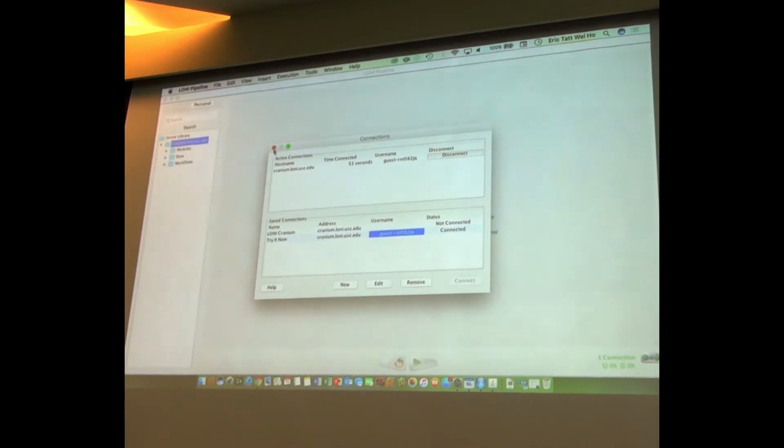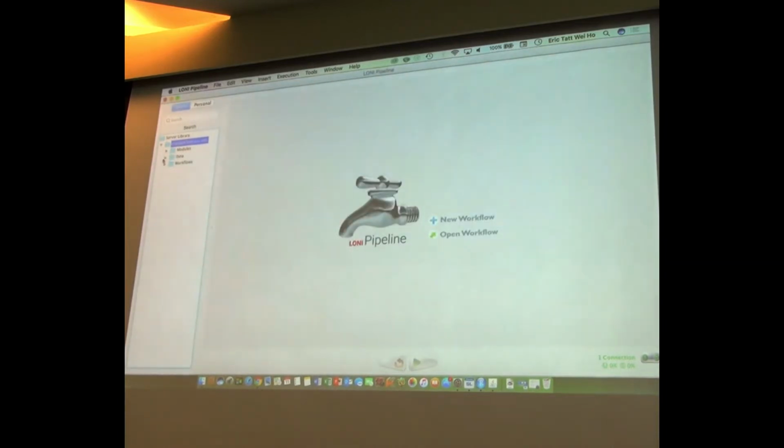Okay, so let me close this. So we have three types of things. We have data sets that you can use. We have modules, and the modules are a very extensive collection: AFNI, AIR, automatic registration, bioinformatics modules, BrainSuite modules, diffusion weighted imaging modules, the European Molecular Biology Open Software Suite, FSL and FSL5, FreeSurfer 5.3 or 6, I'm not sure.